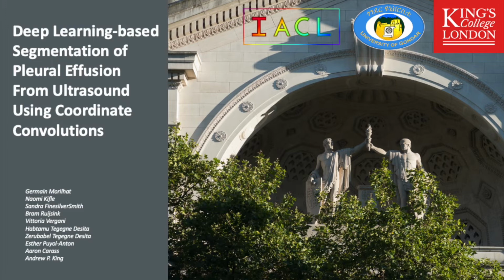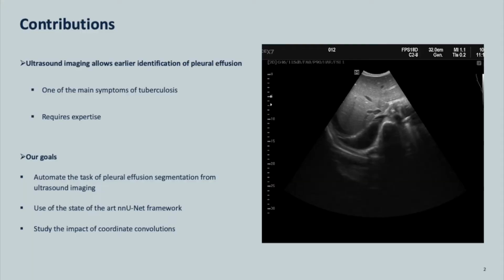Hello everyone, I would like to talk about my work on the use of deep learning to simplify the clinical workflow for the use of ultrasound to assess pleural effusion. This work is a collaboration with partners from the Gondar University Hospital in Ethiopia. Ultrasound imaging allows earlier identification of pleural effusion and a grading of its severity, which allows better treatment allocation.